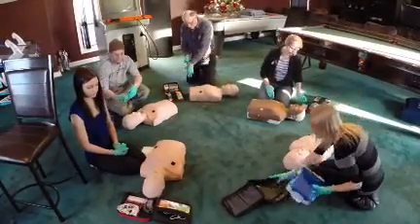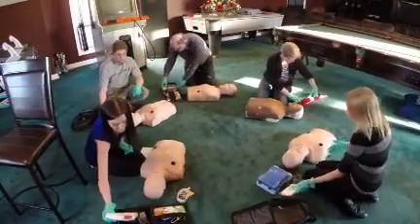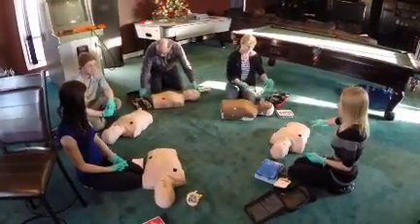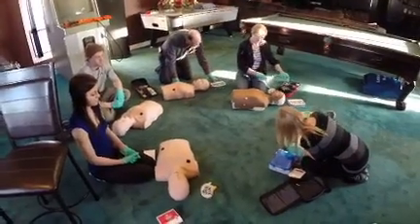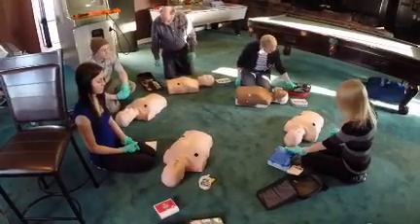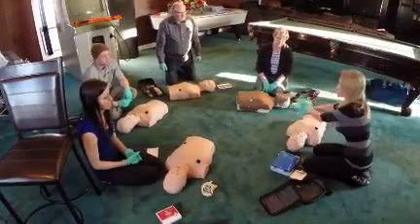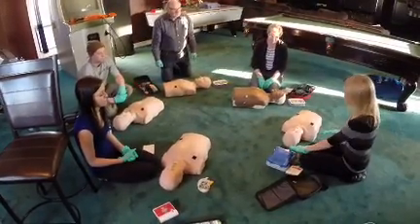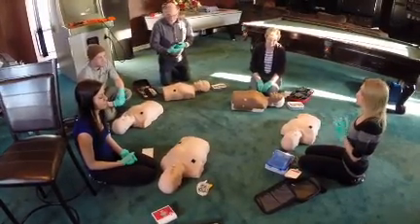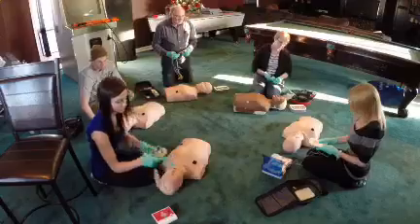Now when you go to pull it out, you're always going to put it at the head of your casualty, because when you go to press that shock button to administer the shock, you want to make sure nobody is touching your casualty. So you're going to want to make sure you look down your casualty, make sure that there's nobody touching. And it's going to tell you don't touch the patient. You also should go don't touch, clear, don't touch, okay? Just to make sure everybody is aware. They might not have heard this because this is a scary situation, right? Okay, so the first thing we do, we pull it out, is we turn it on, and we just follow the prompts.